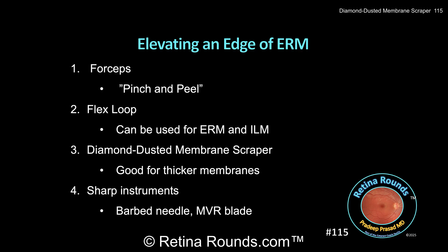Depending on the surgeon's preference, a separate forceps can be used. In today's video, we showed you the Tano Diamond Dusted Membrane Scraper. This instrument can be helpful for thicker or more tightly adherent membranes. It isn't quite as gentle as the Flex Loop, though, and it has to be used with caution. If too much pressure is applied to the retinal surface, it is possible for the Diamond Dusted Membrane Scraper to damage the inner retina or even create retinal breaks.